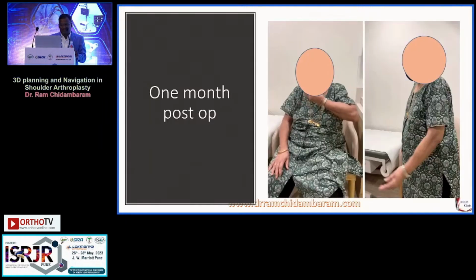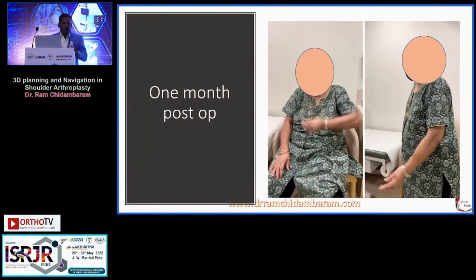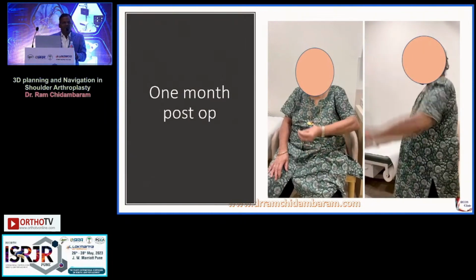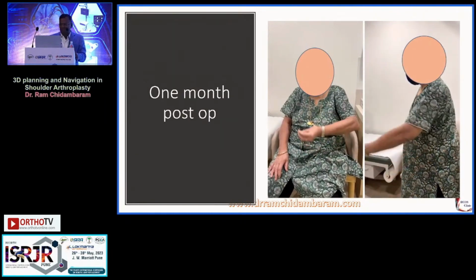And that is her, reviewed last week at 1 month follow-up. This case was done 1 month ago. So that is the range of active flexion and abduction and easy use of the hand at follow-up.